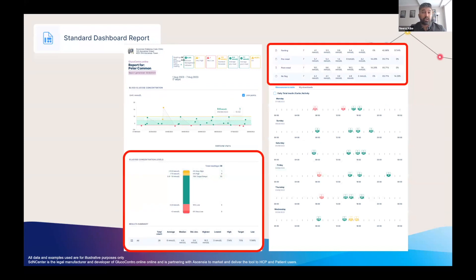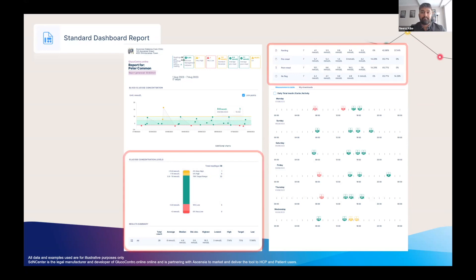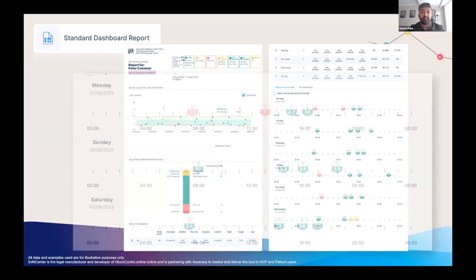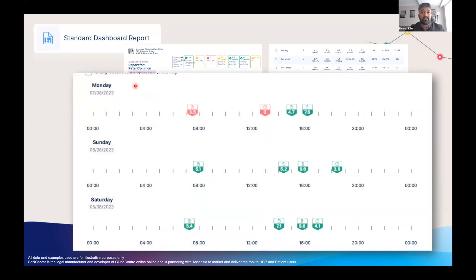After the timeline graph, there is a bar chart showing the percentage of readings below, in, and above their reference ranges, along with a table showing it broken down based on fasting and pre and post meal time flags. The last part of this report shows readings plotted for each day by the time they were recorded. The most recent day is shown first. Each reading shows the exact value and the meal marker if flagged. With the colour coding, you are quickly able to see any readings of concern or ones for future discussion.